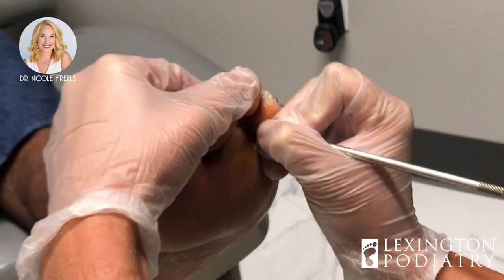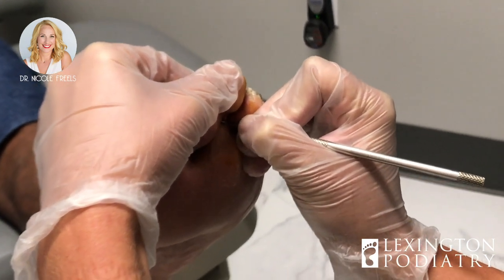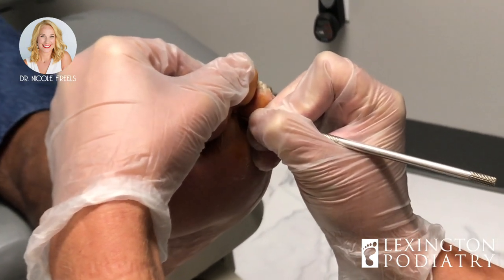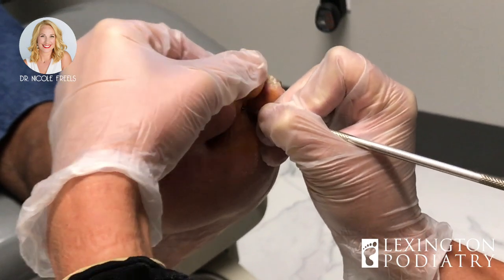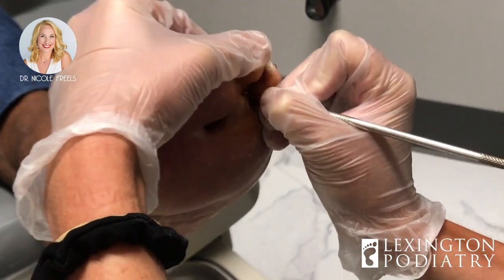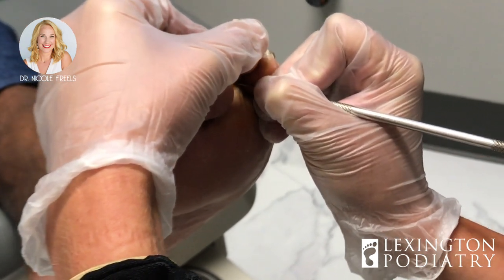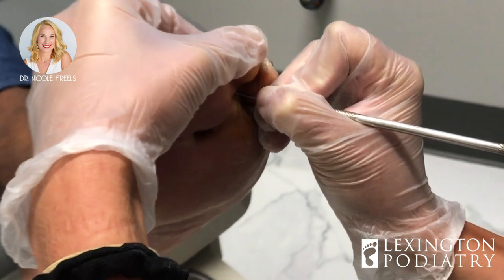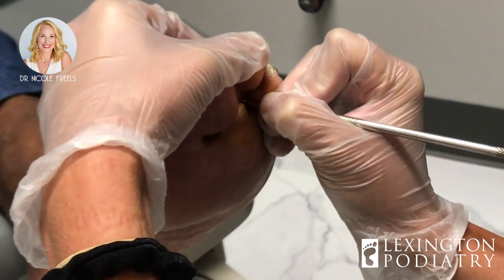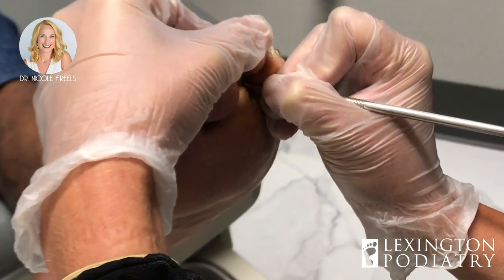So once I hit the tendon, I'm getting the capsule right underneath it. The capsule basically surrounds the joint itself, and then it just completely relaxed. You do still have some contracture in the joint itself — that's kind of bony adaptation I can't do anything about here; that's when we'd take you into the operating room. But this is a simple procedure. A lot of this is feel — you can just kind of feel — but now it's loose; it was not loose before, everything was tightening up.